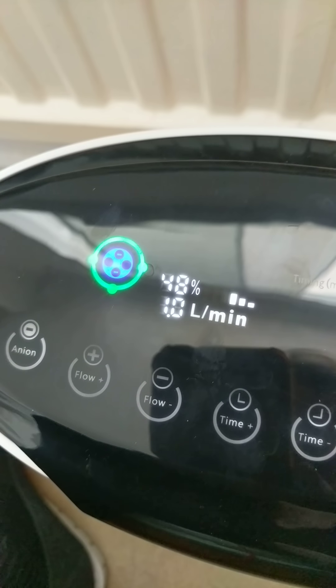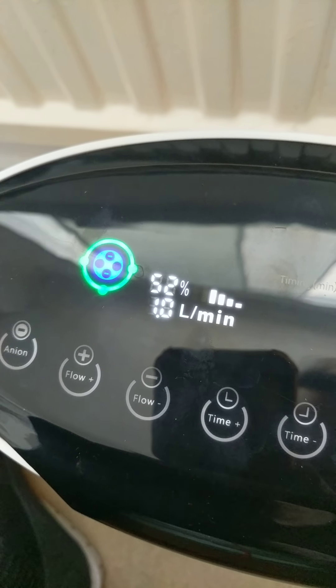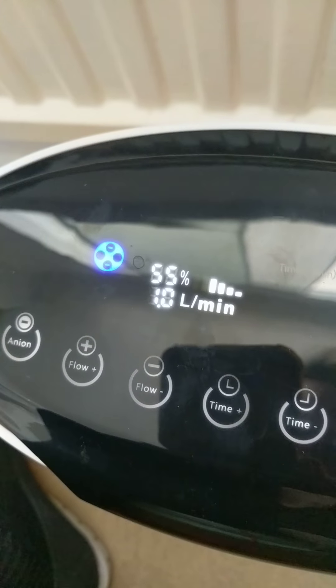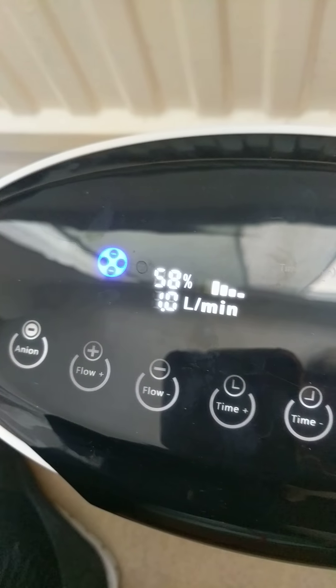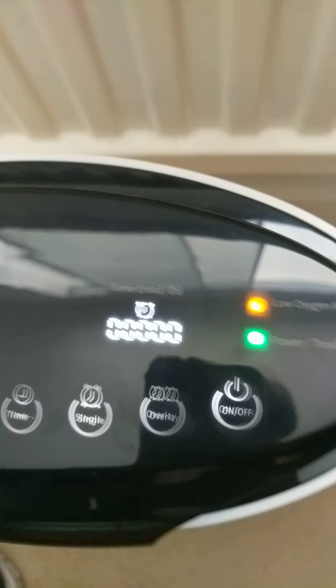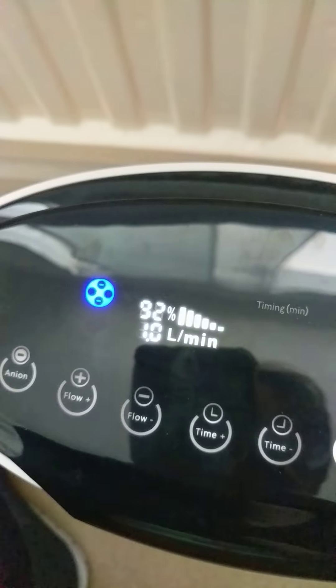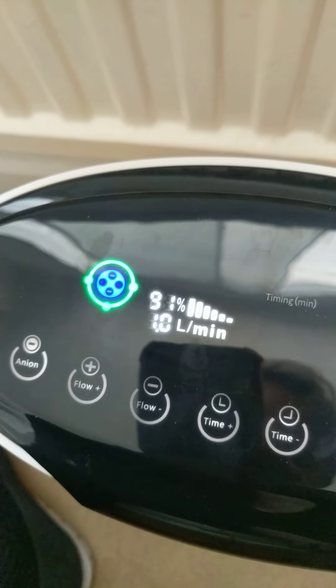You'll notice that this is already pumping out one litre per minute and it's increasing the amount of oxygen. It's going up now to 64, 76, and there's a yellow light that's just turned off — the low oxygen light turned off because it's now at 92%.